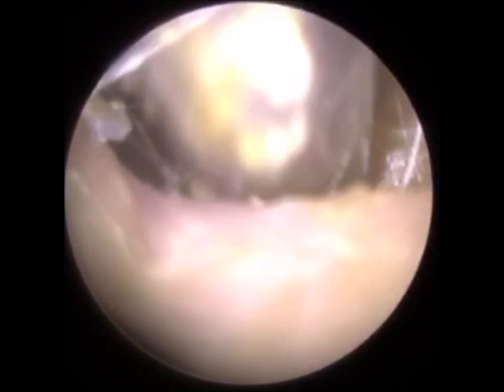So I've just gone in with the ear hook, and you can see at the top there is a bit of an opening. I'm just trying to get the ear hook behind that plug of dead skin, and just to extract this keratin. So I'm just going right behind the plug of skin, and you can see how damp it is. It's just slicing through like a hot knife through butter almost. But again, we got a bit out, so slow but steady progress.